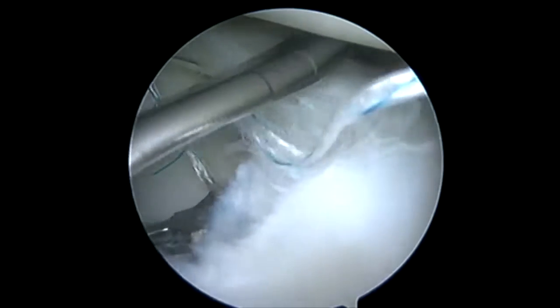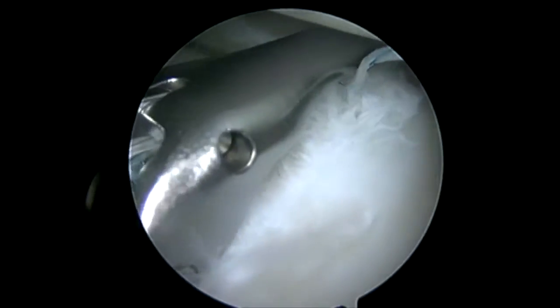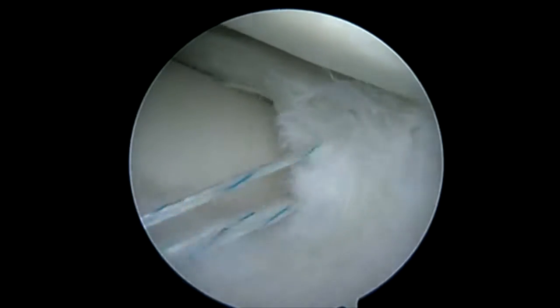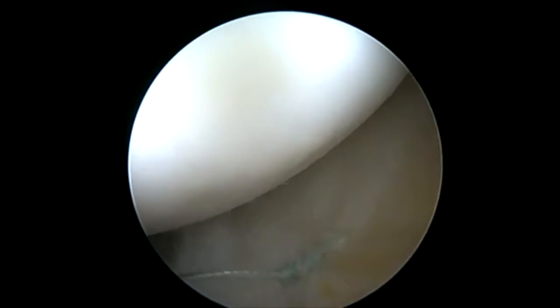Otherwise, I pass as far as I can anterior with the Nova Stitch Plus and tie standard vertical mattress, or if the meniscus has been shortened, barrel stitches to basically re-contour this meniscus.